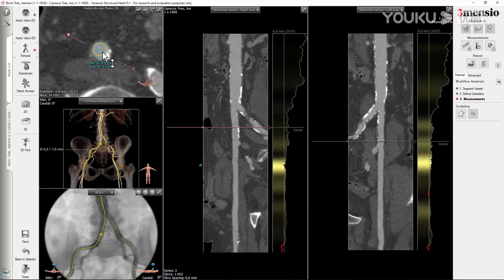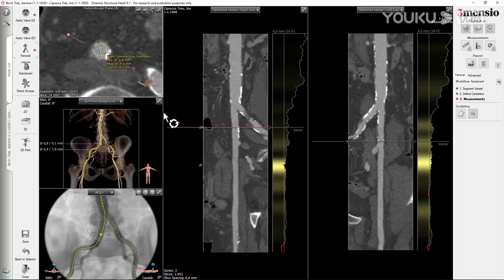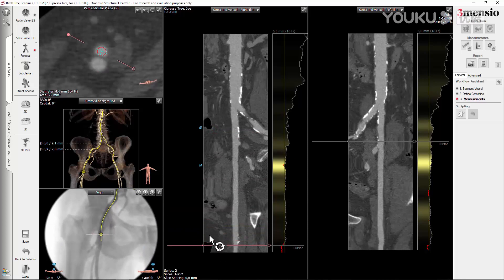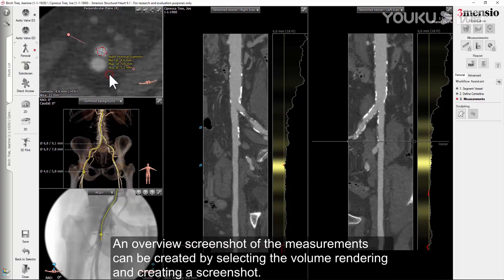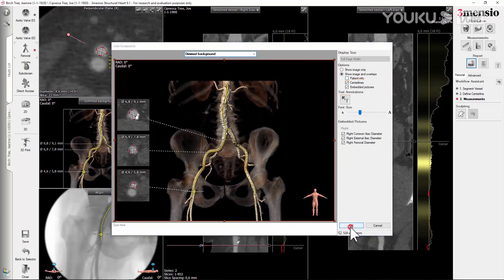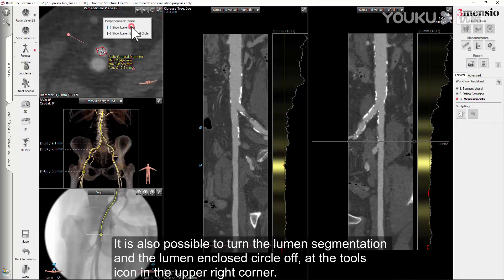An overview screenshot of the measurements can be created by selecting the volume rendering and creating a screenshot. The Embedded Pictures box needs to be checked. Thumbnails of the individual measurements are shown. It is also possible to turn the lumen segmentation and the lumen-enclosed circle off at the Tools icon in the upper right corner.